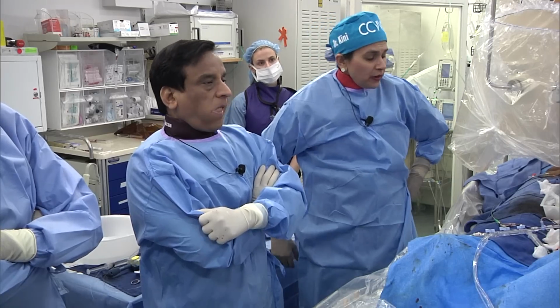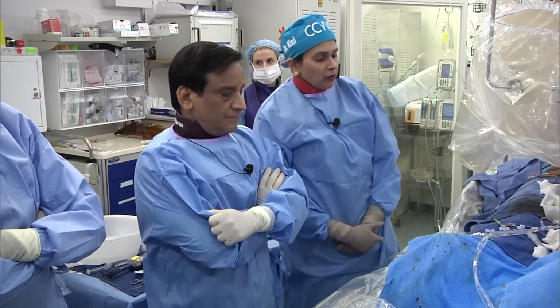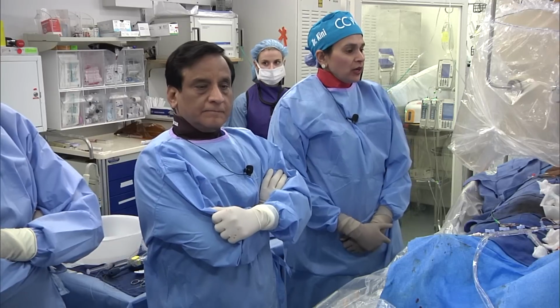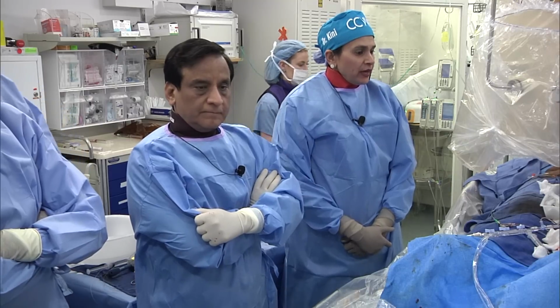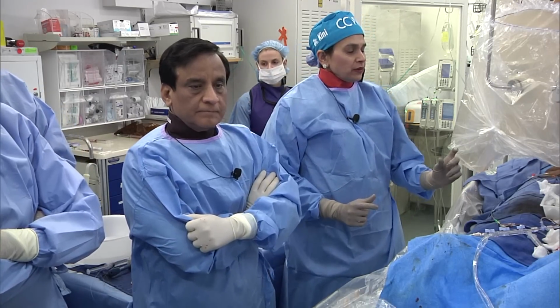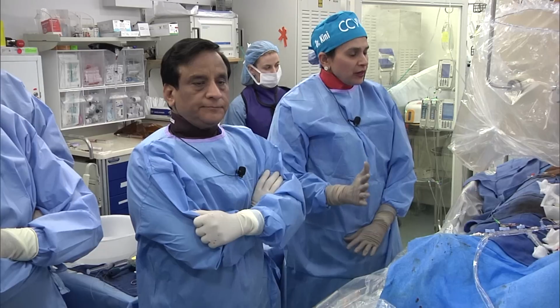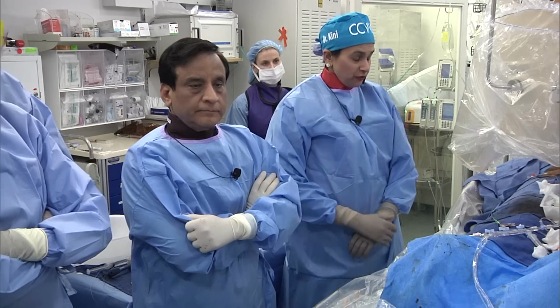We actually did POT, which, let me explain, is the proximal optimization technique. Essentially, you do it when you are stenting and there is a discrepancy between proximal diameter and distal vessel diameter. Like you see here, LAD was about 3.3 I would say, and then left main just above 4.0, and I actually confirmed it was above 4.0.